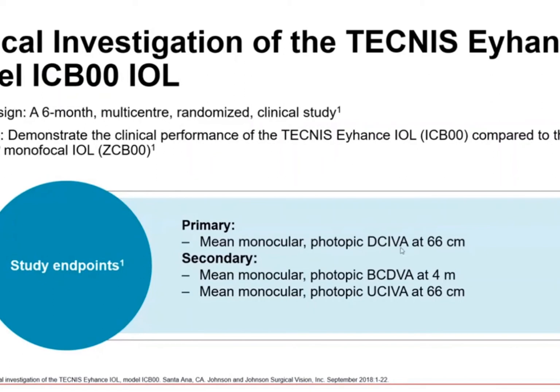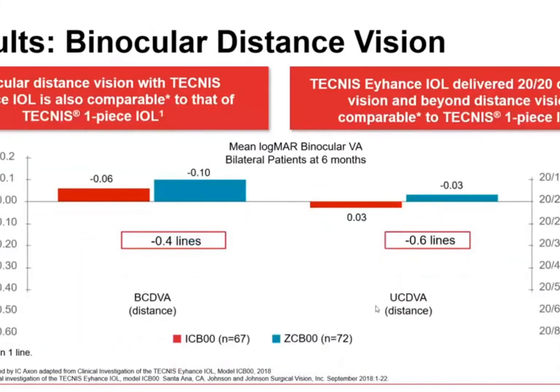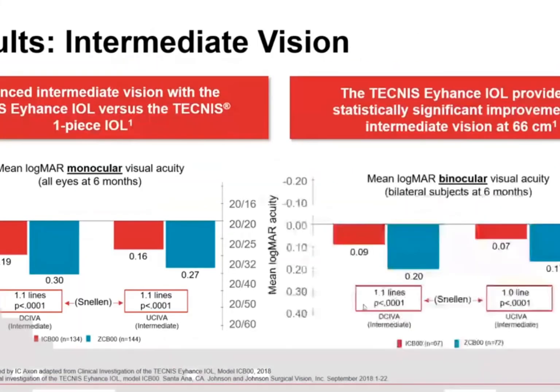Right, so this takes away any refractive error that's associated with the IOL power that's implanted. Now, uncorrected intermediate VA here means that it includes whatever refractive error is induced by the IOL that is not being corrected. So obviously you see a difference in the results. If you look at the distance corrected intermediate versus the uncorrected intermediate, there's always going to be a difference here.